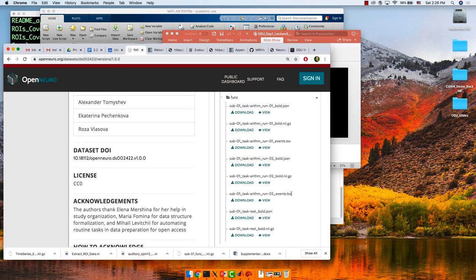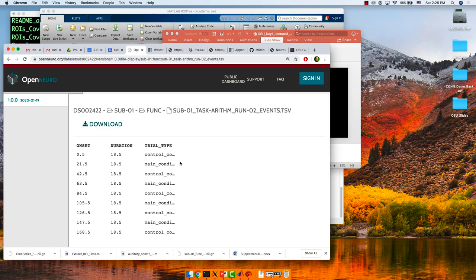Everything on OpenNeuro is organized in BIDS format — there's a subject number, anatomical directory, func directory, and so on. If you're doing a task-based connectivity analysis, you'll see TSV files with the basic things you need: onset in seconds, duration in seconds, and the trial type. If you output all your timing files into this format, you can load them into the CONN toolbox and it will read them automatically, assigning everything to the right subject, condition, and timing. It's like witchcraft — it just knows where things are based on how they're labeled.